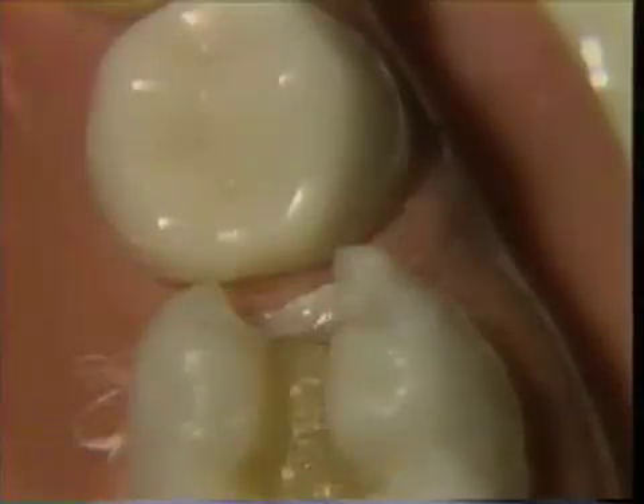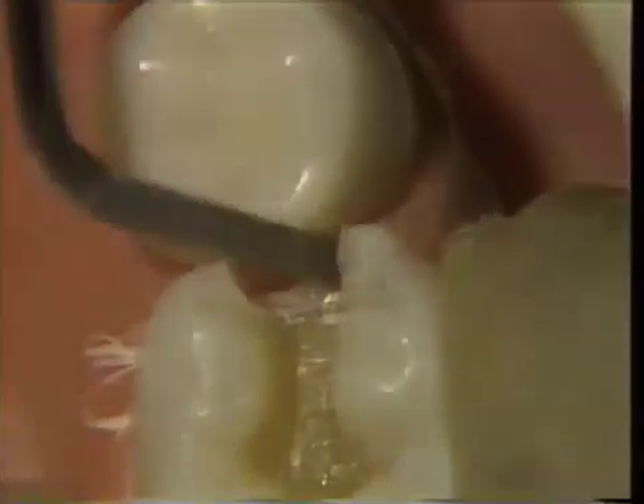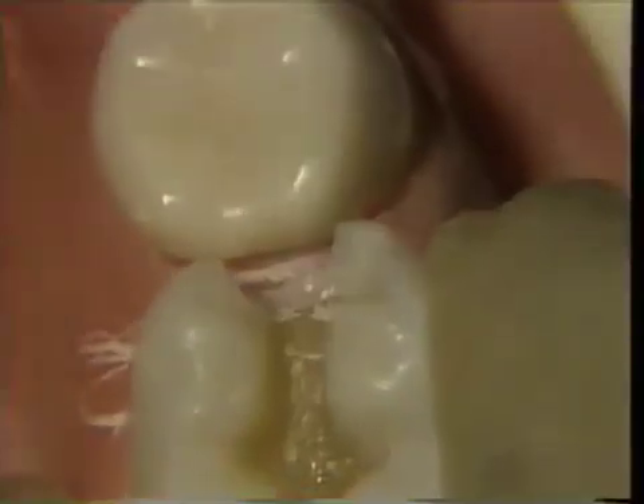A gingival marginal trimmer is used to place the two bevels of this cavity preparation: first, the bevel of the cervical enamel — note how rough the enamel looks on this preparation — and secondly, the bevel of the pulpo-axial line angle. In beveling the cervical enamel, care must be taken with the buccal and lingual corners of the proximal box. As the instrument is carried across the cervical floor, it must not strike the cervical corners of the proximal box, as a sharp groove would be cut into these corners making it difficult to properly condense amalgam. Therefore, the marginal trimmer should be started one or two millimeters on the proximal wall, brought down past the corner, and out onto the cervical floor for one or two millimeters. Then the normal movement of pulling across the cervical floor is accomplished. The gingival marginal trimmer is then used to bevel the pulpo-axial line angle.